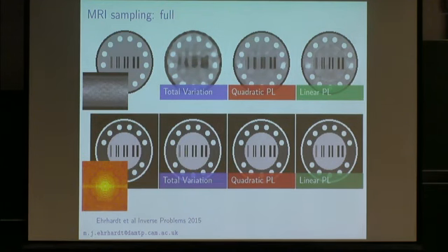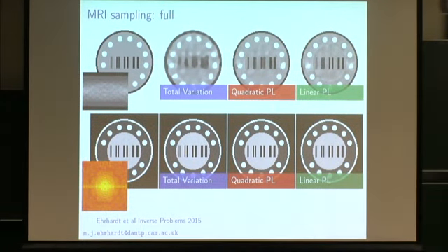Now I would like to show you some numerical results at the end. We have two images that are structurally similar in some sense. They have lots of structures in common but very different intensities, and a few structures that are present in one image but not in the other. If we reconstruct from this, it turns out that total variation for PET is not able to recover the image well, so you have a loss of resolution. If you have the full MR data, you reconstruct the MR side very well. And if you do a joint reconstruction, one thing that is very nice and promising is that you do not degrade the MR result, but in addition you enhance the PET.